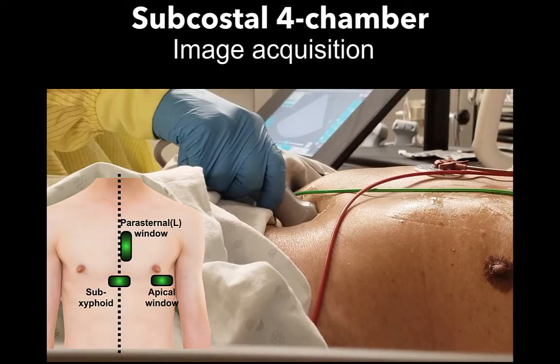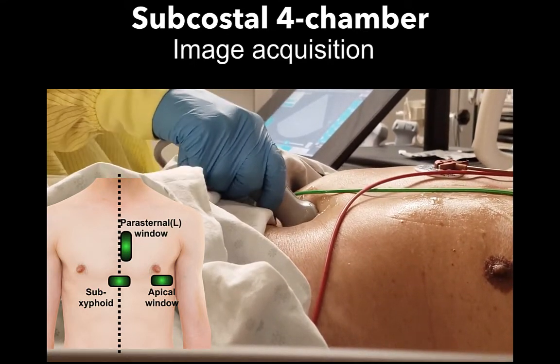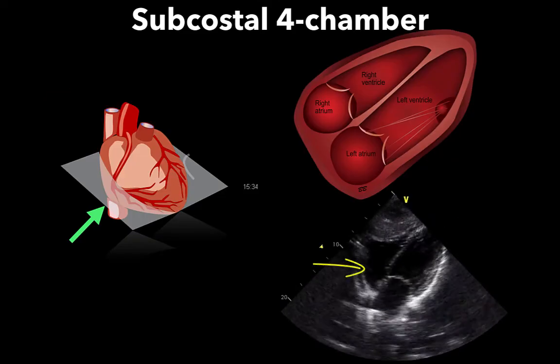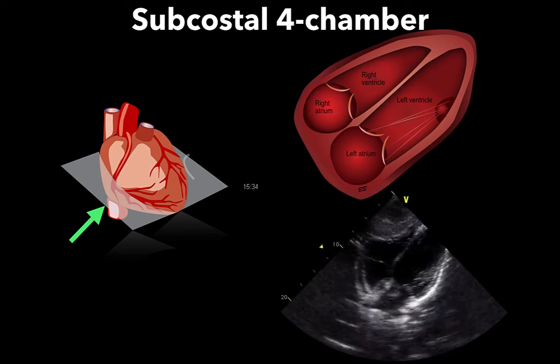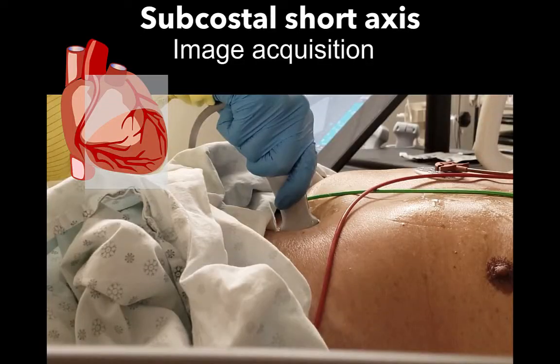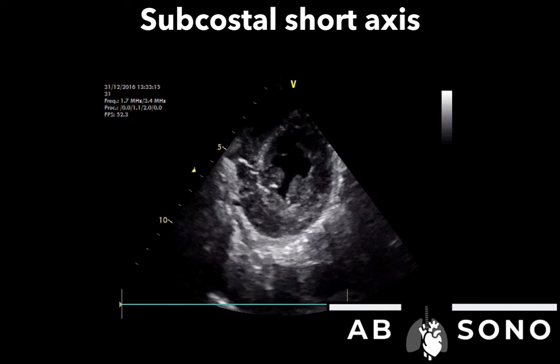Moving on to one of the most essential views in critical care — the subcostal four-chamber view. This is essentially the subcostal version of the apical four-chamber. The probe marker faces the patient's left side, and the probe is simultaneously depressed and fanned to yield the correct plane. We can see the pericardium, right atrium, and right ventricle most anteriorly. The left atrium and left ventricle are seen in the far field. This view is often the most practical to obtain in a critically ill patient who is severely unstable. You can make a slight derivation and move the probe 90 degrees counterclockwise to review a subcostal short axis — essentially the same sagittal plane as the IVC but fanned towards the patient's left or towards the heart. This can be really essential to add more information if all you have is a subcostal view.